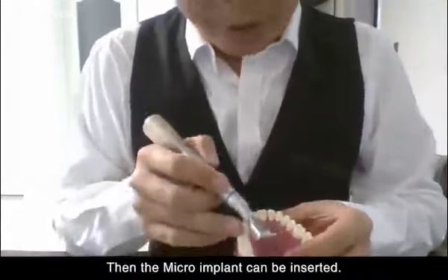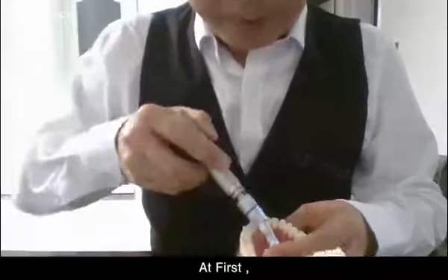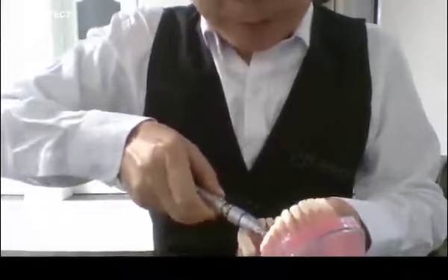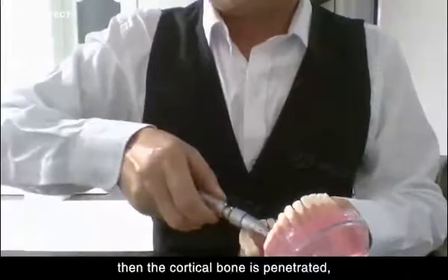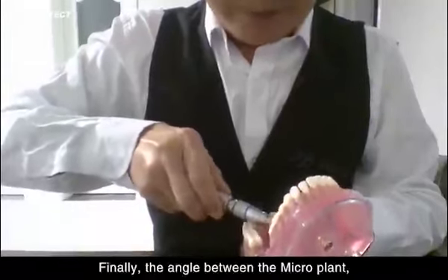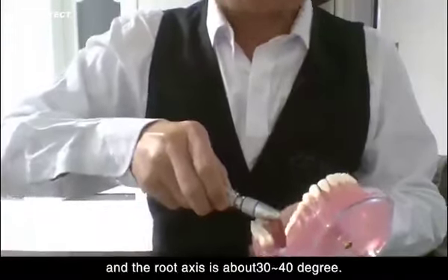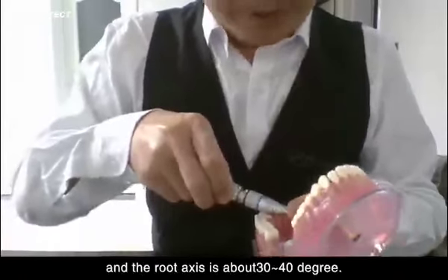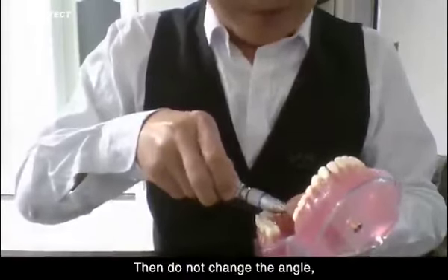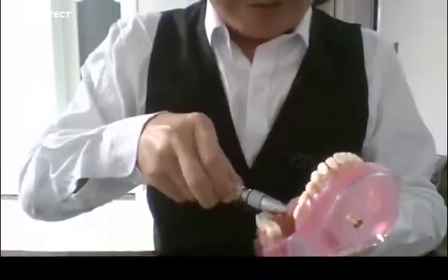Then the micro-implant can be inserted vertical to the bone surface at first. Screw the handle, and when the cortical bone is penetrated, then change the angle. Finally, the angle between the micro-implant and the root axis is about 30 to 40 degrees. Then, do not change the angle. Screw the handle until the tip goes to the end.